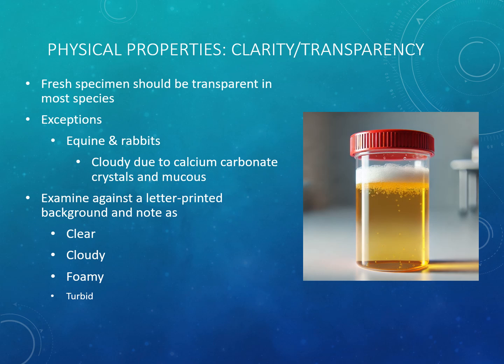When we're looking at clear urine, there's usually no sediment in it. It's healthy urine. Cloudy is kind of the next step up.